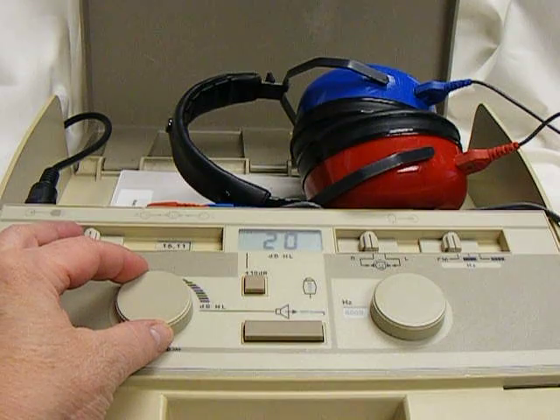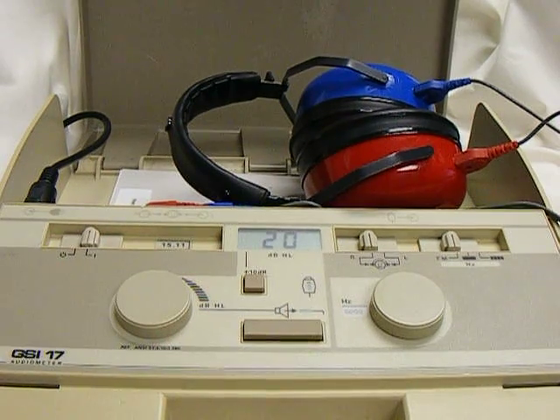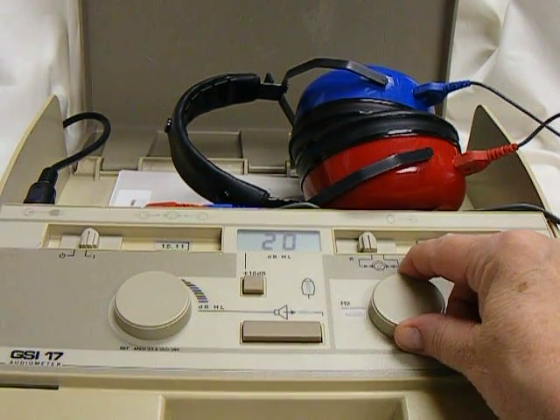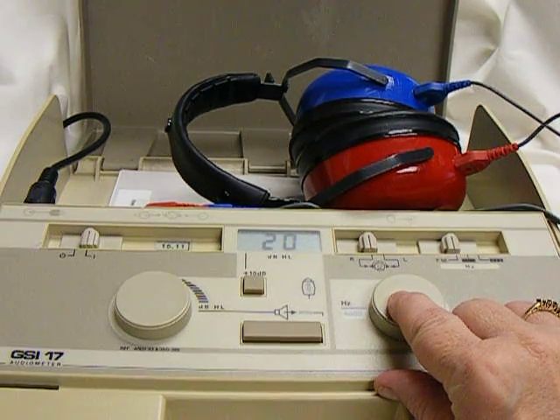This knob controls your intensity or loudness. We test at 20 dB. This knob controls the frequency of the stimulus you're presenting, so you have high and low pitch sounds.